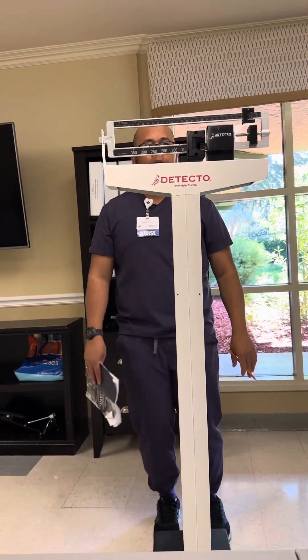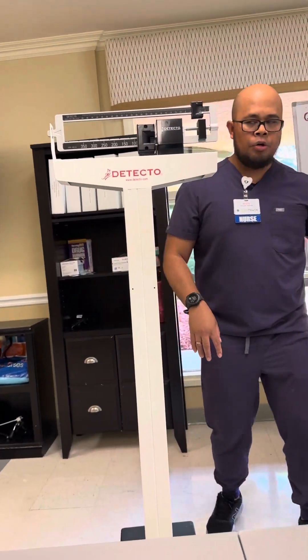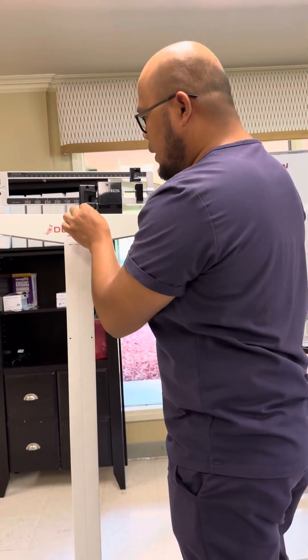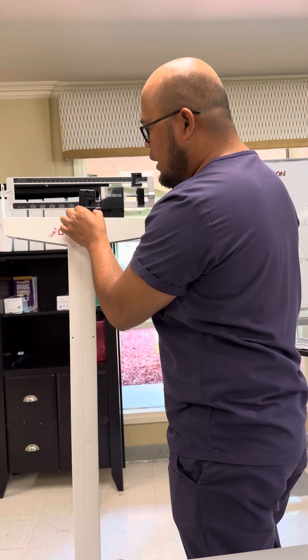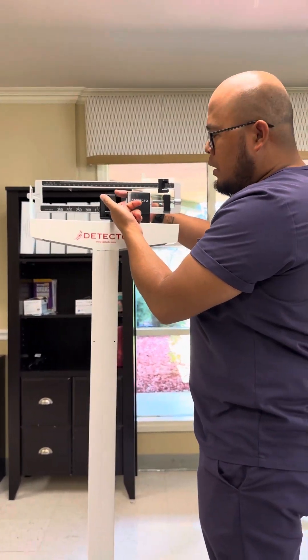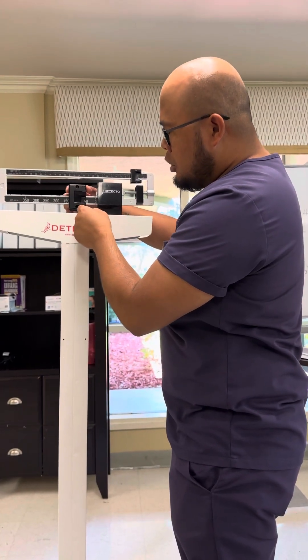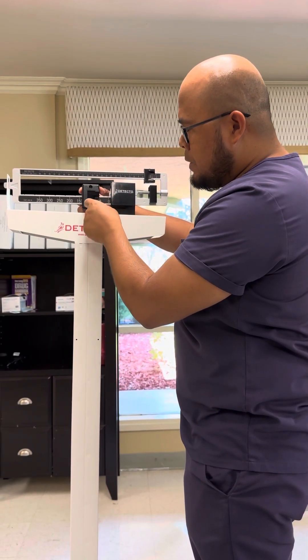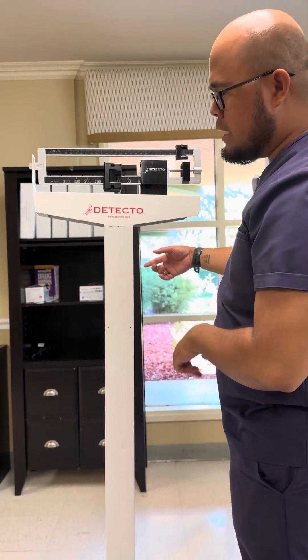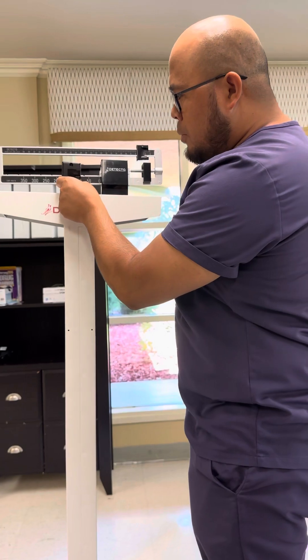You let the patient step on the scale and then measure. You're going to be on the side while looking at your patient. Go ahead and measure the patient's weight. See this claw right here? Make sure this claw is aligned — for example, at 50. That's not how it works if you put it just anywhere.